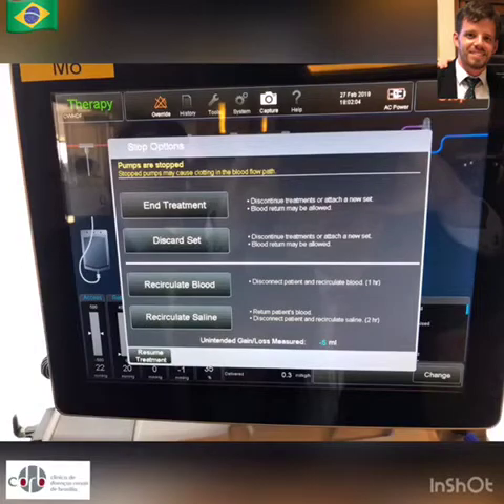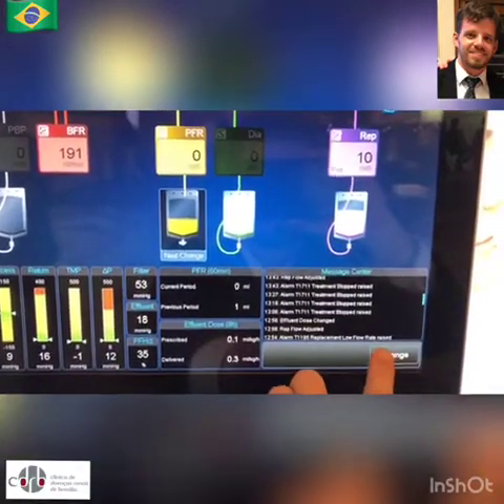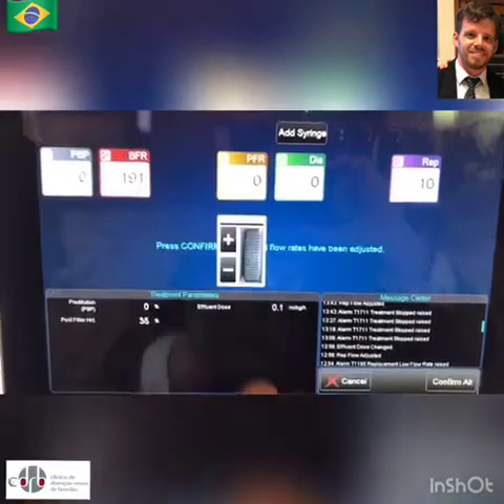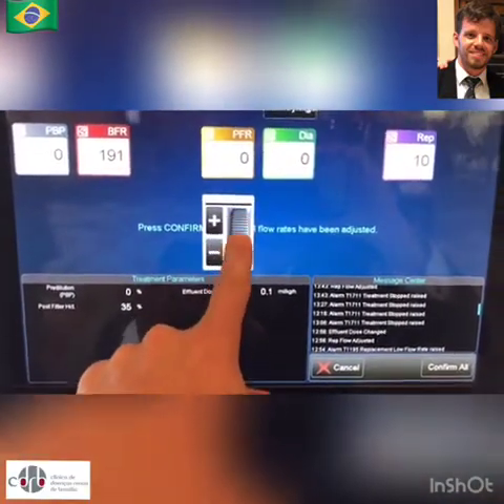There is also level adjustment, and stop options like recirculating or resuming your treatment. Here I am adjusting the new effluent pump, which was not enabled because this is a demo mode.